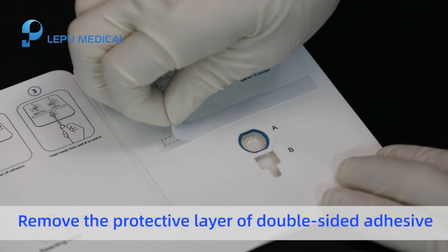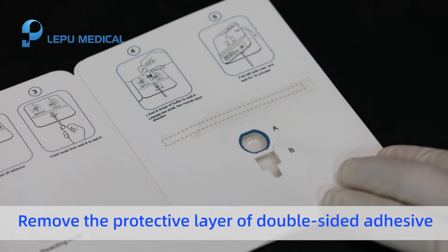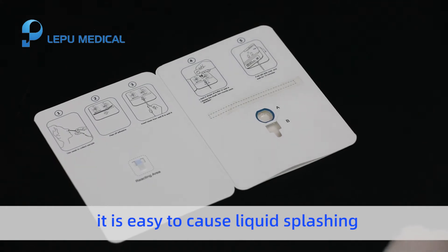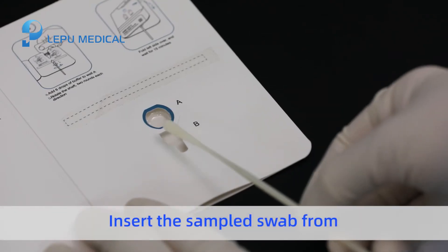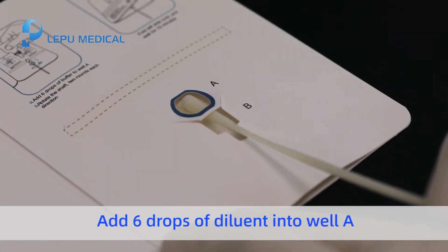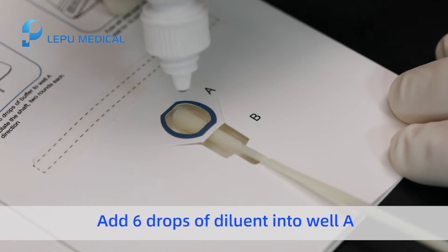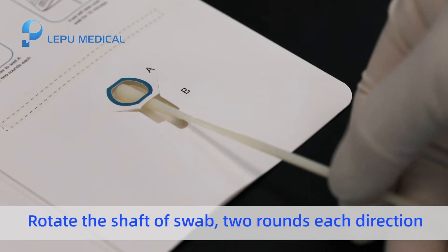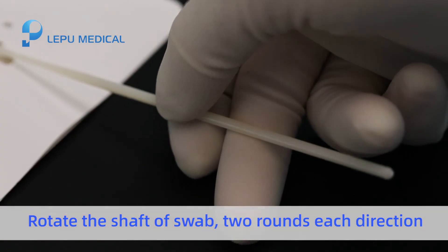Remove the protective layer of double-sided adhesive. If the protective layer is torn off after adding diluent, it is easy to cause liquid splashing. Insert the sampled swab from the bottom of well B into well A. Add six drops of diluent into well A. Do not drop the diluent into the other well. Rotate the swab two rounds in each direction.